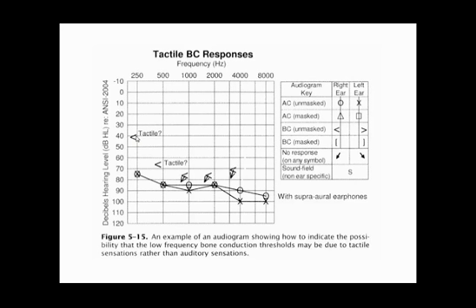And if they say that they feel it, then we could write VT next to that symbol, and VT means vibrotactile. The patient actually doesn't hear it, the patient feels it.